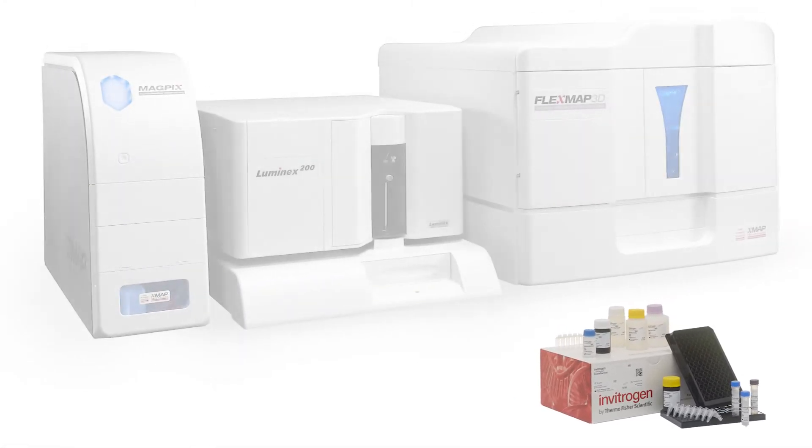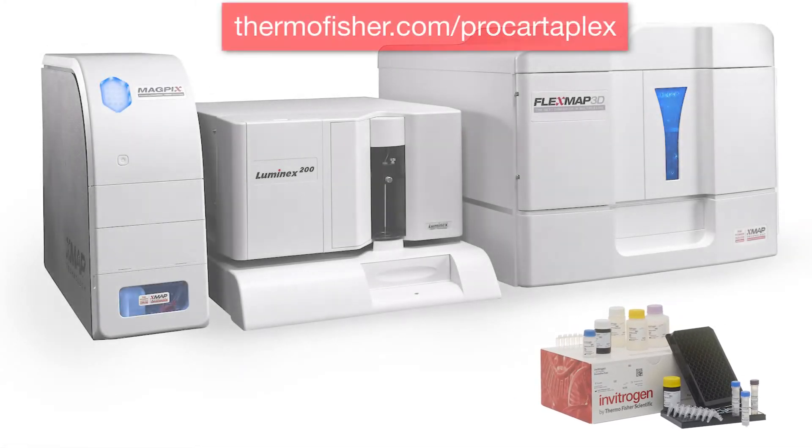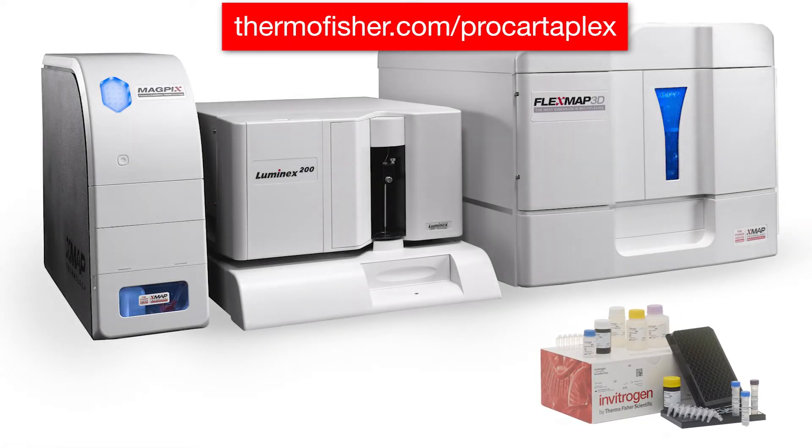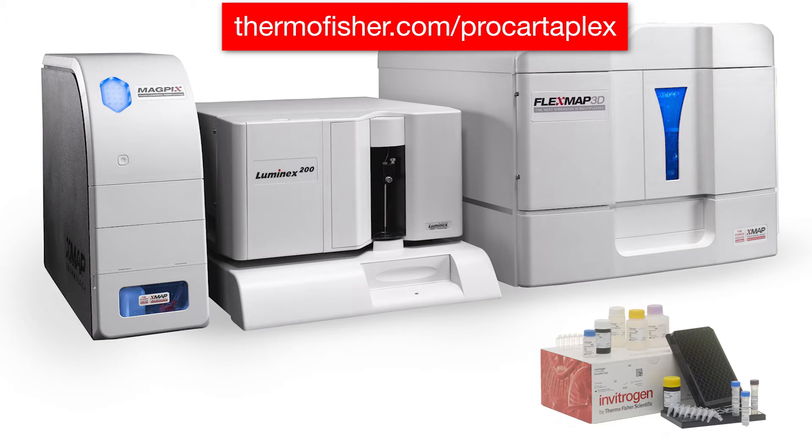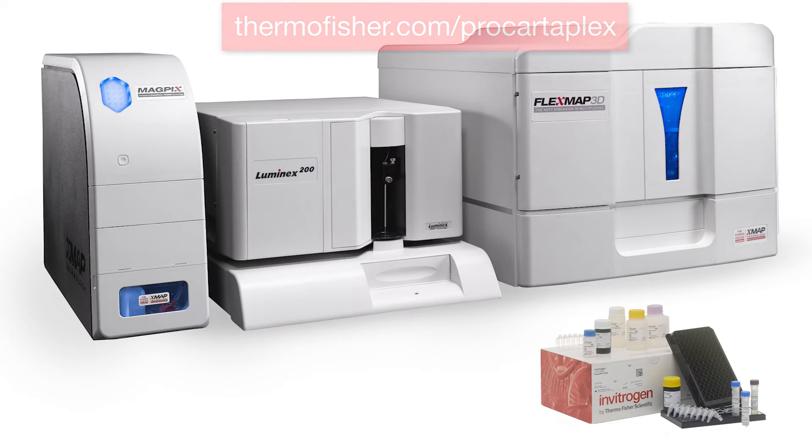Please refer to Instrument User Guides for applications involving the Luminex FlexMap 3D, Luminex MagPix, and Luminex XMap Intelliflex instruments. Exponent software settings for the ProCartoPlex Assay can be found in the ProCartoPlex Assay User Guide.